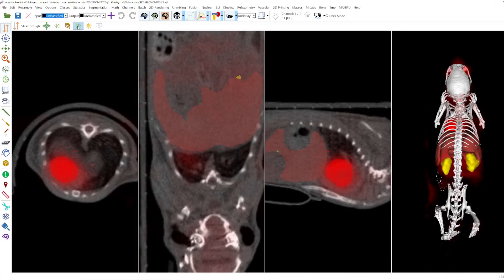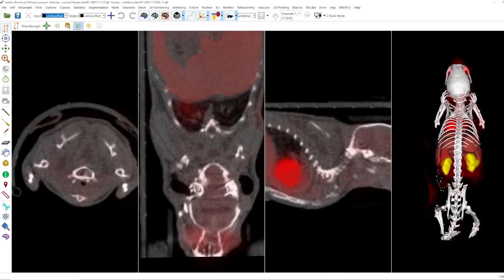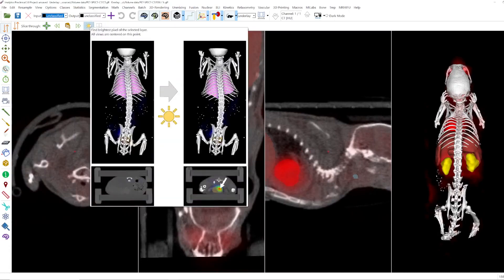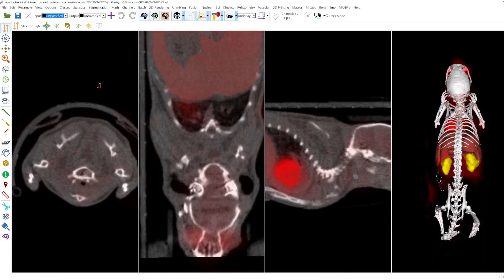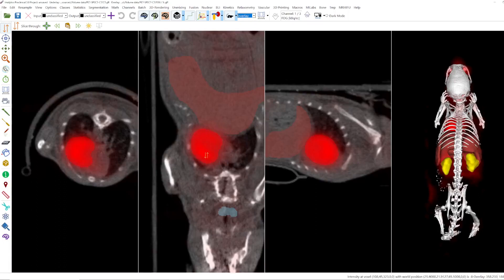And with this button here you can jump 10 slices up. With the button symbolized by the sun you can find the brightest voxel of the selected layer, and all 2D views are centered at this point. For example for the underlay we have a voxel here inside the bone, and if I now choose the overlay we go to a very bright voxel inside the heart.